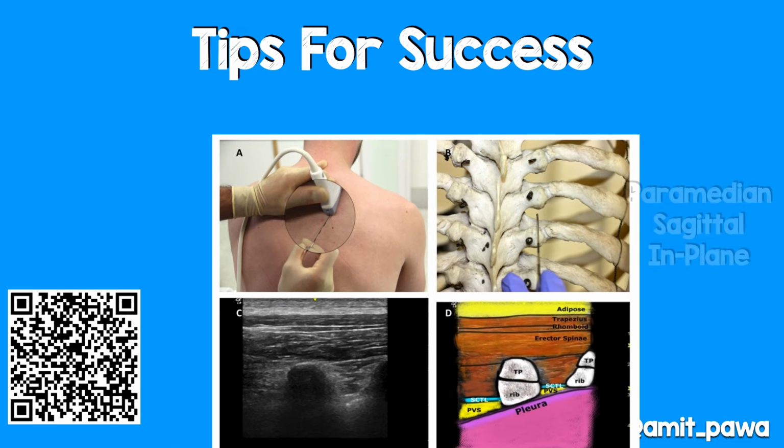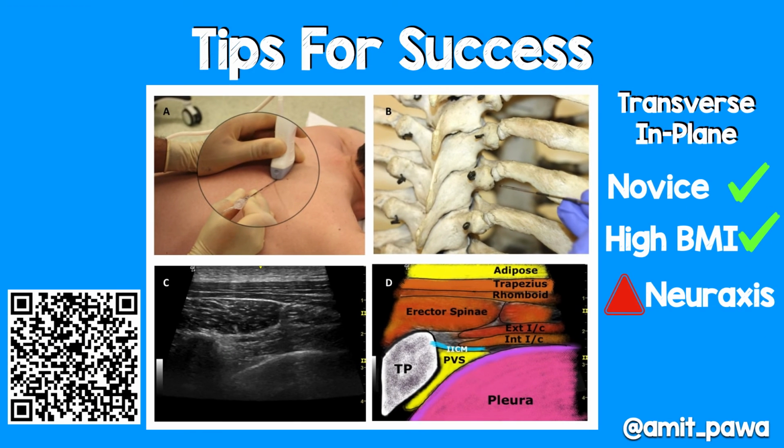the endpoint. But I have now moved across to doing transverse in-plane needling, because with the patient in the prone position this is slightly easier to do, and I find that novices find this an easier technique to perform. In patients with a high body mass index, it's actually easier to perform this particular technique, but be careful because you are directing a needle towards the central neuraxis.